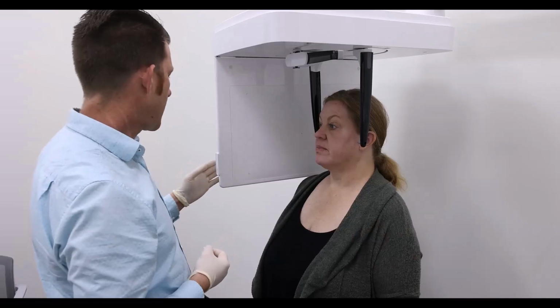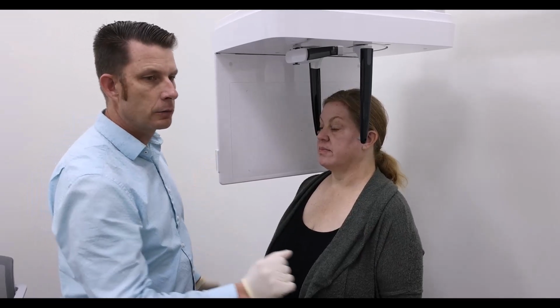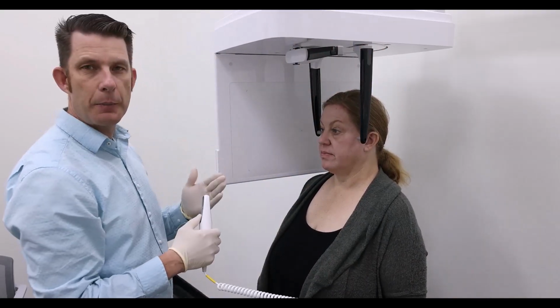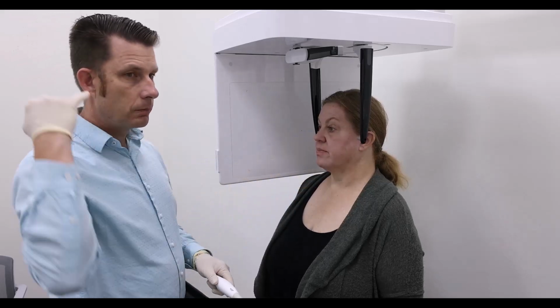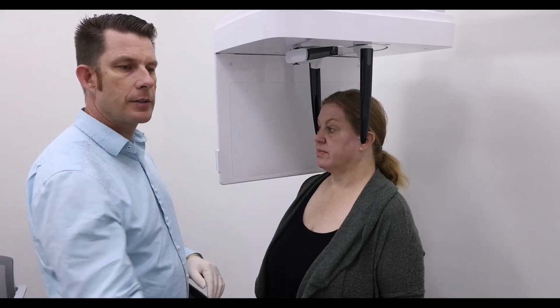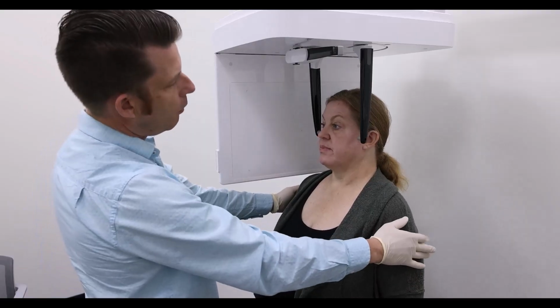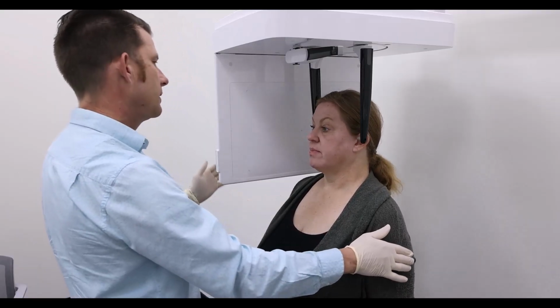The first thing I'm going to do is raise my height up or down with my hand switch, either on the column here, or we may have our hand switch here where we can raise this up or down. What I'm looking to do is get our ear rods into the ear canals. So go ahead and stand up straight and tall and walk forward for me just a little bit. And I need to lower the device down.